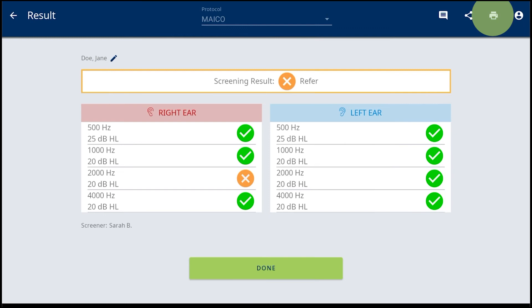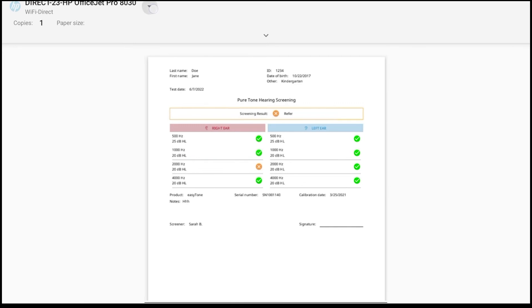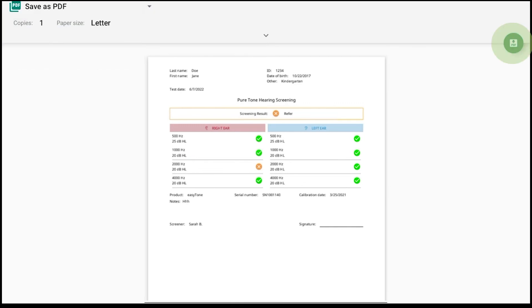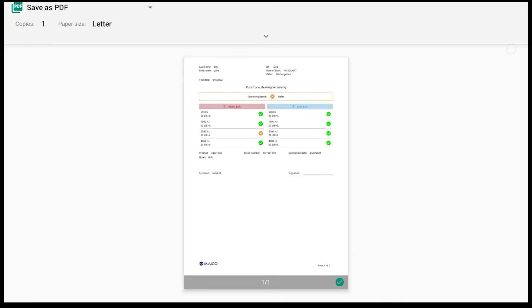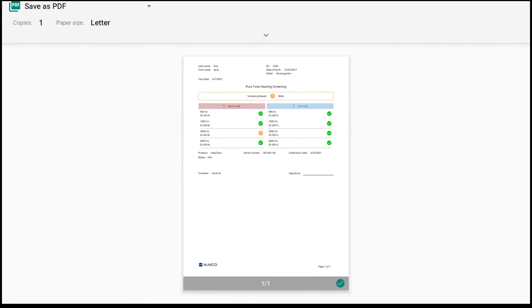The print icon allows direct printing to a Wi-Fi or a Bluetooth printer. These printer options must be set up within the Connected Devices setting of the Android tablet. Printing to a PDF is also an option and stores results within the download file of the tablet.